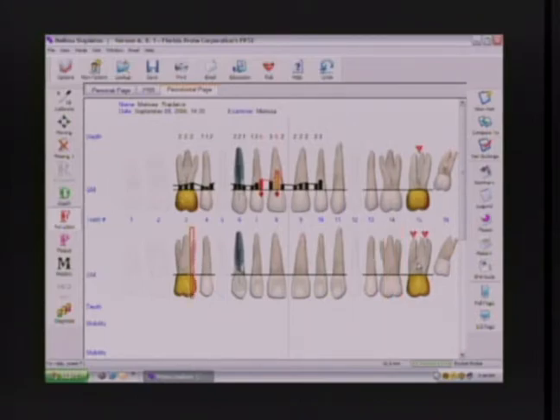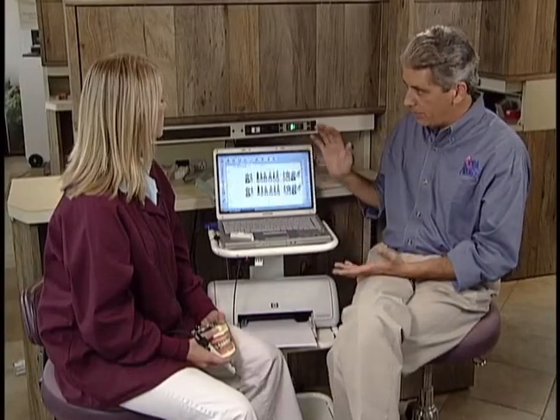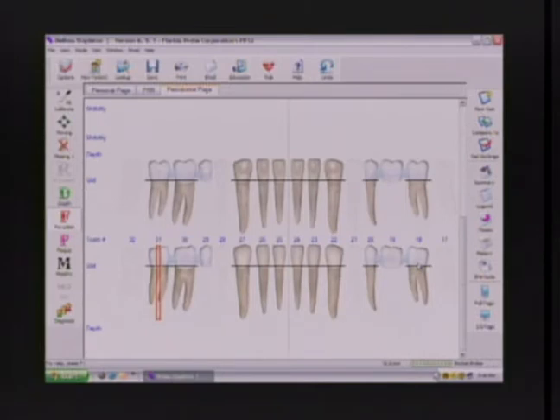Midline. And we pause. We confident in the upper arch? Yes. Advance. Lower arch. We refer to the monitor. Where did the cursor go? 31. Buccal of 31. Class 1. 1. Class 2. 1. Midline. We wanted a class 2. We got a class 1.